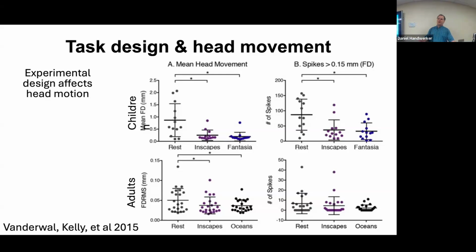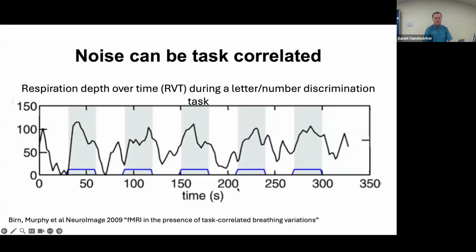Some of it I think was covered in Brock's talk. There's a bunch of different methods. I've worked on several, and none of them are perfect. The paper I mentioned earlier discusses some variation. What was noticed in this paper is that the respiratory effect is on a slightly different time scale than your task effect, so it might be possible to remove things that are at one lag but not another. There are other methods, like a method called Rapid Tide by Blaise Federer's group, and some other things. They're all regression-based methods that might help.